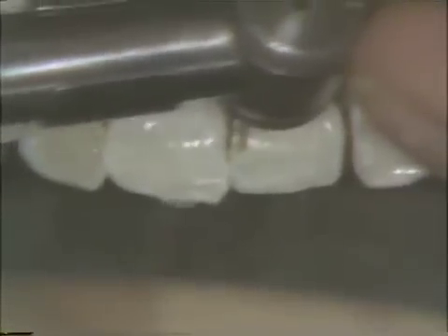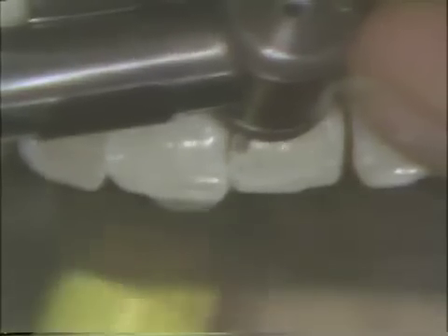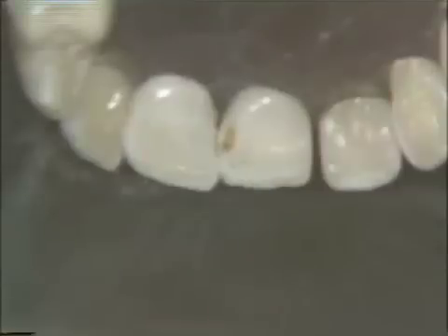We've decided that there still is that bit of decalcified enamel and also some caries in the dento-enamel junction. So we're back in removing this. We will not use the high-speed burr to remove caries beyond the normal depth of a cavity preparation.